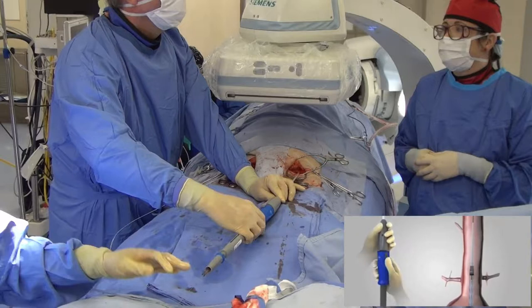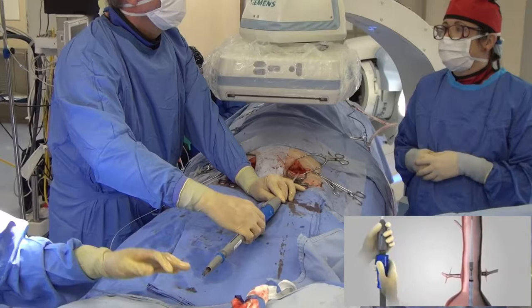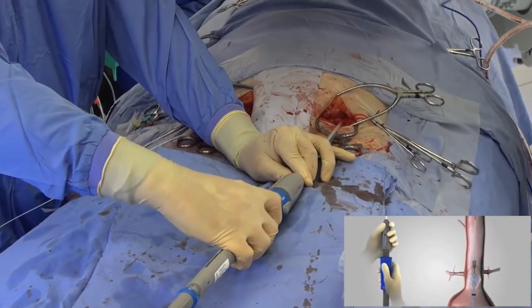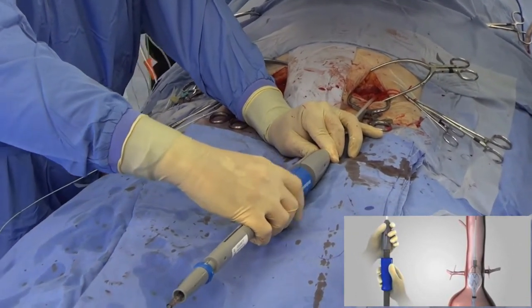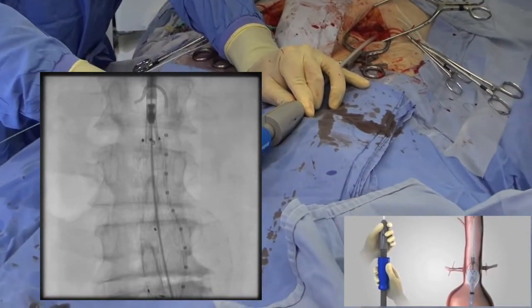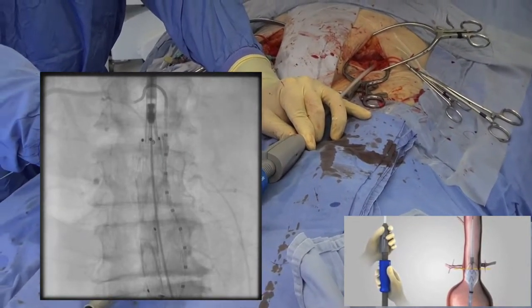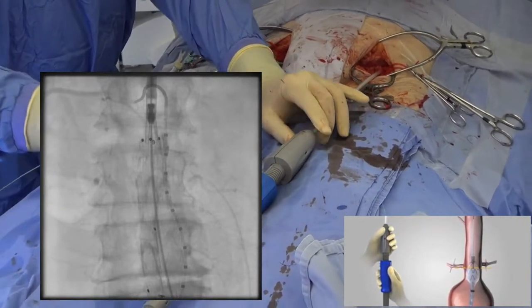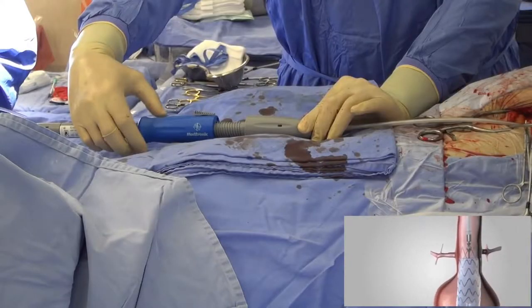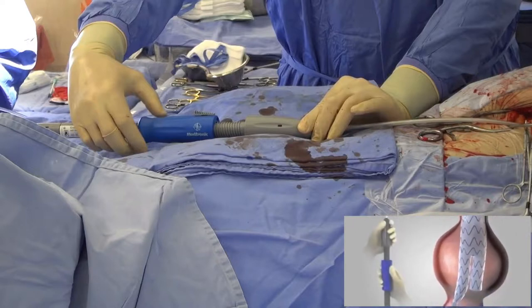By turning the delivery system of the stent prosthesis in an anti-clockwise direction, the plastic cover is pulled down, deploying the stent inside the neck of the aneurysm. Placement is confirmed by injecting contrast through the pigtail catheter. After the proximal position is confirmed, the rest of the main body is deployed, including the limb extending into the left iliac artery.